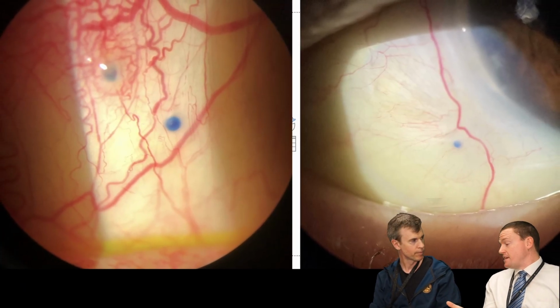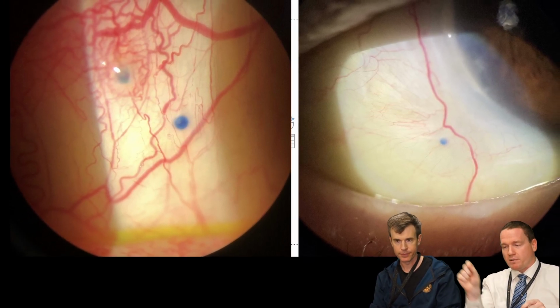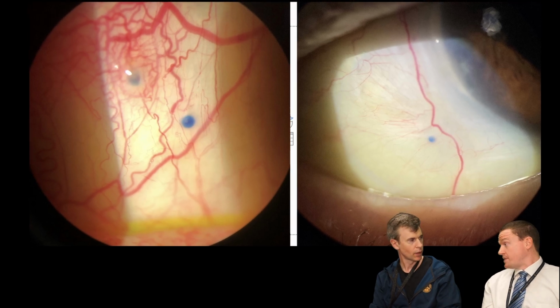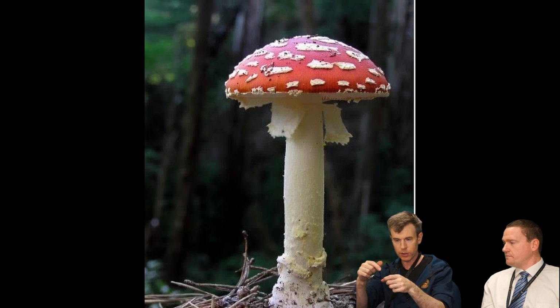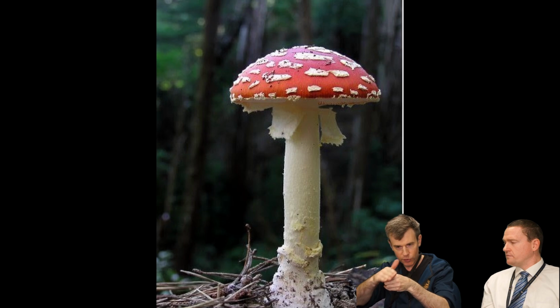One other interesting point about this case was those little blue parts that become a little bit bulbous and stick in the sclera. You actually see those for the rest of their life. Yes. You look at a post-op and I can see those four small little blue dots that indicate where that's been pressed into the sclera, and it doesn't cause any problems and it just stays there forever that way. And the head is like a little mushroom. So the reason I like this technique is because it's placed directly into the sclera and then it's a smooth surface. So if it's a little bit elevated, it's a very nice smooth surface that the conjunctiva covers.